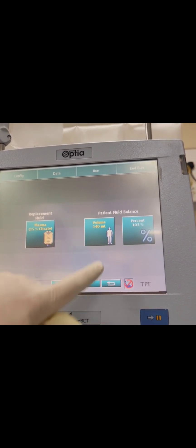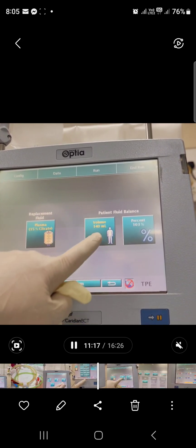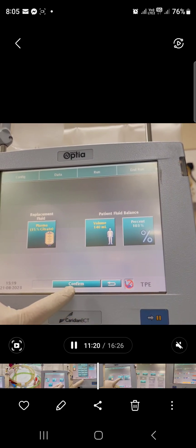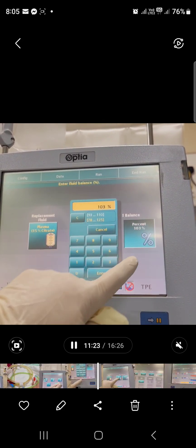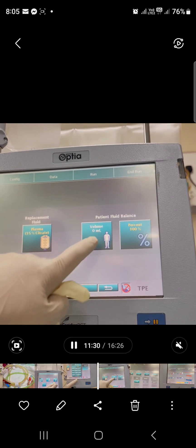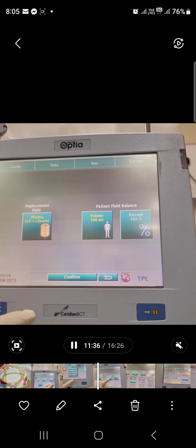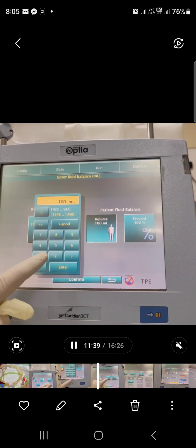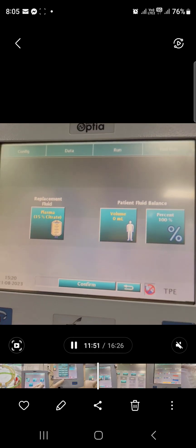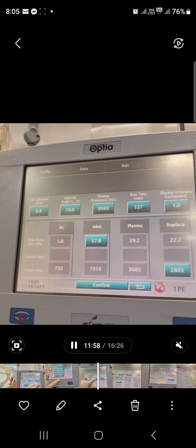Select fluid type. Choose fluid type as plasma. The volume — do not change anything in the volume; just make sure the percentage is 100%. Then press plasma for the fluid replacement. Plasma for fluid type, percentage will be 100%, then press continue.